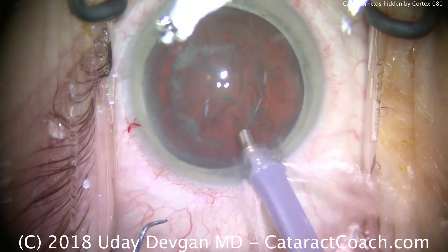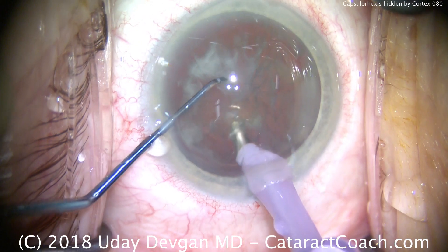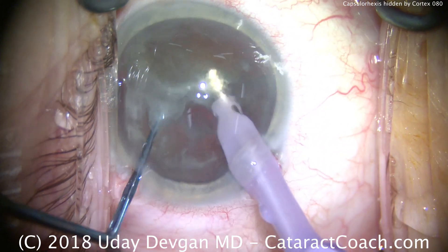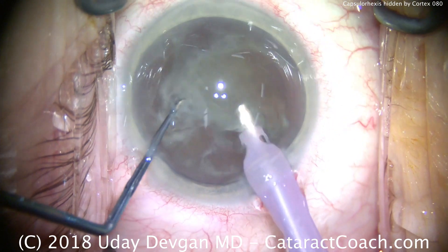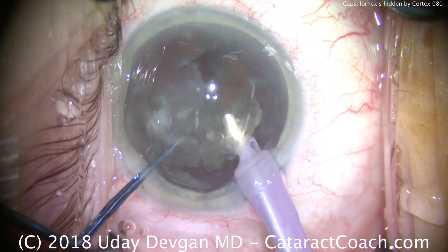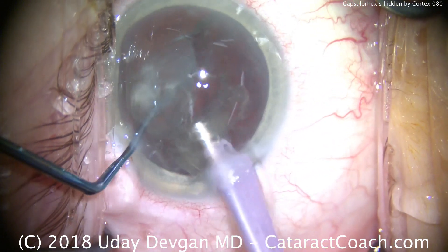Here's our probe. Again, we're doing a chop technique — basically my standard technique for most cases. Buzzing over the chopper and the probe, we try to split the nucleus. With a lens like this there are a lot of opacities, but it's not particularly dense, so that single chop at the beginning of the case is likely going to be sufficient to remove the whole nucleus.